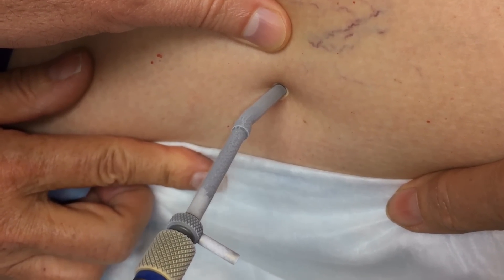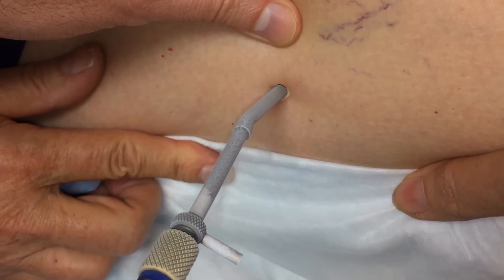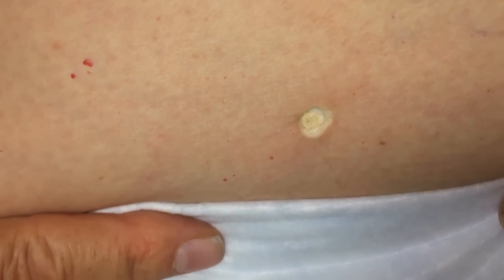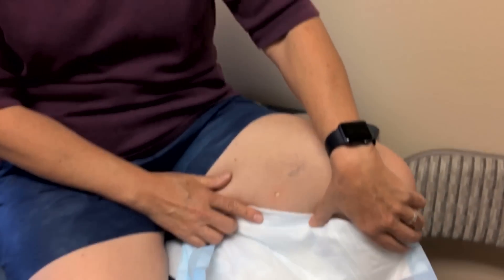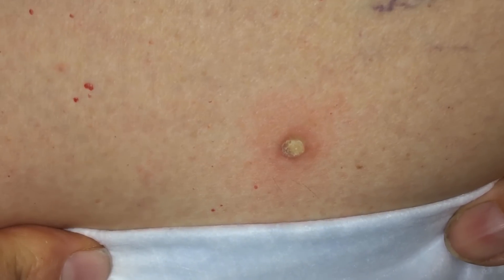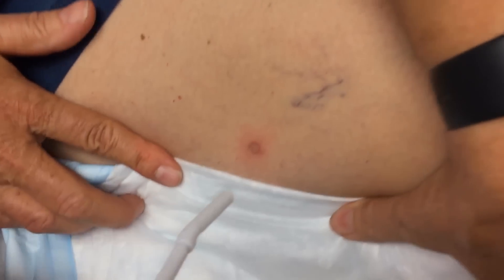It dented in a little bit. We're gonna let that thaw out, and then once it does we'll hit it again. You said 'ow' — surprisingly it wasn't as bad, yeah. And the last time it wasn't bad either, and it just dropped off. Okay, this should finish it off so we don't have to do a third time. Yeah, that was a pretty thick one before but it just turned kind of a gray color and then I felt it just flick off — one day it just dropped off. That's usually how they go.